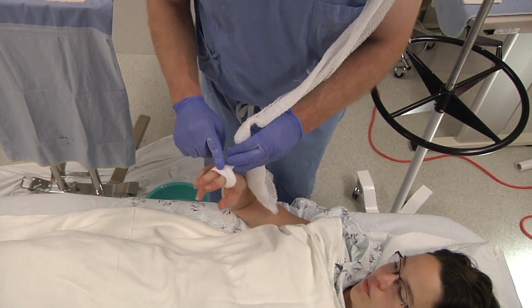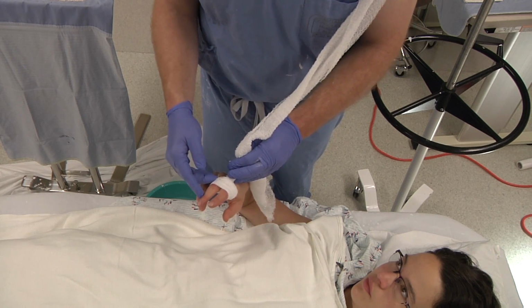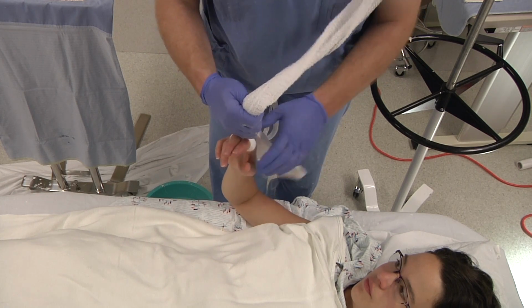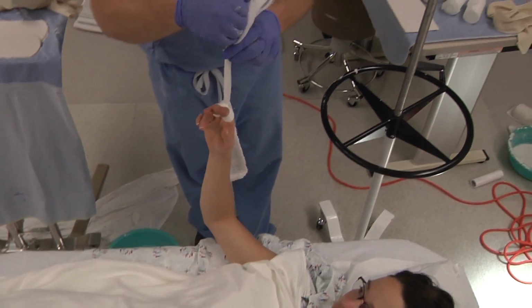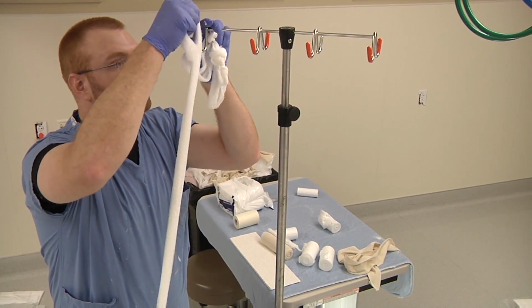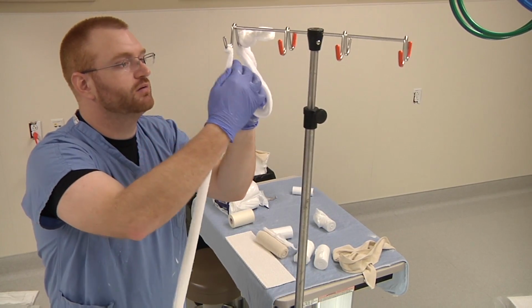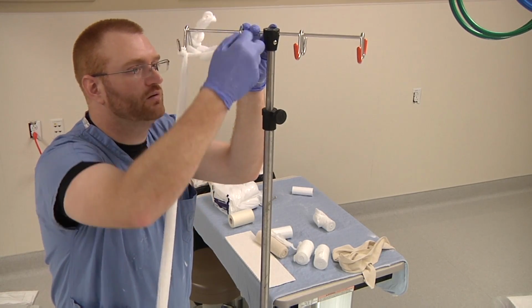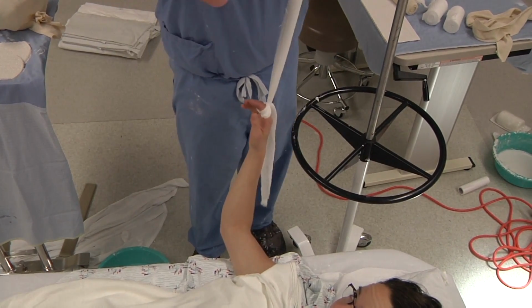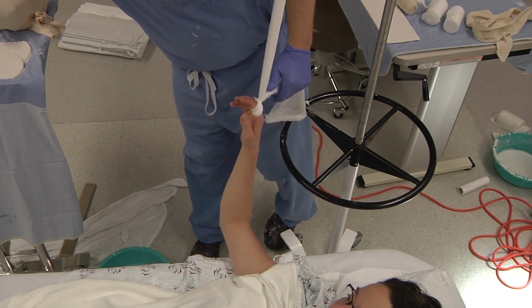It's very important to remember though that this is somewhat constrictive, so it should not be left on for an extended period of time, as it has the potential to cause injury to the fingers distally. Same with finger traps and some of the other possible traction devices. From there, you can secure it to an IV pole. Just make sure that it's adequately secured and doesn't have a chance of dropping the patient's arm. Height you can always adjust by changing the bed height as is necessary to make it a little bit easier. You can easily cut off any remaining.